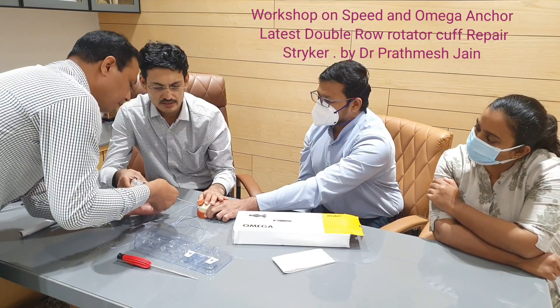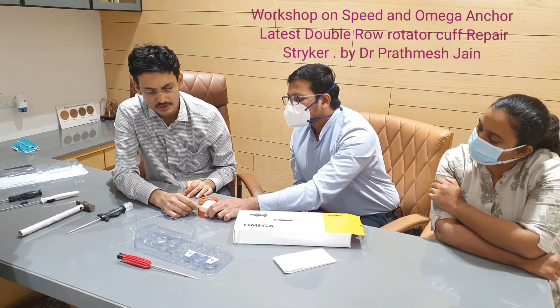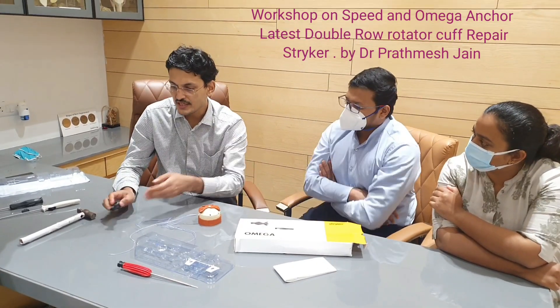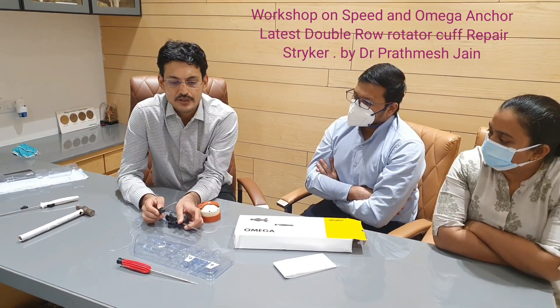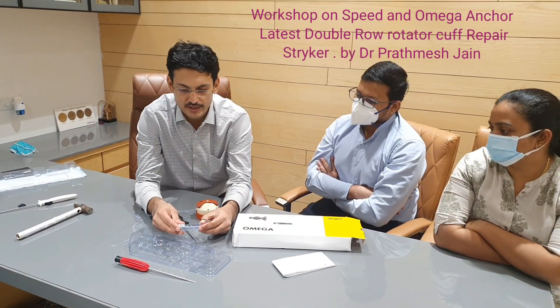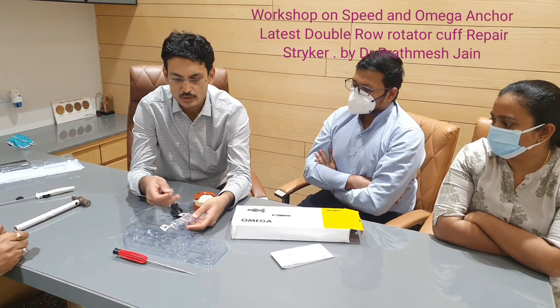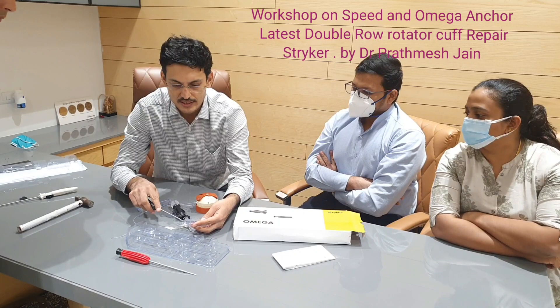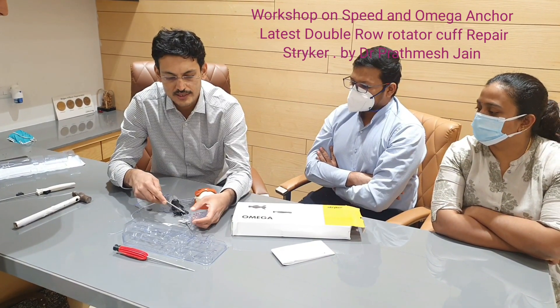After releasing the tapes, the fixation is done and you can cut the tapes. A major advantage of this system is that both devices can be reloaded — there is another set of anchors here, and you can load both devices again. Place the new anchor like this to reload.